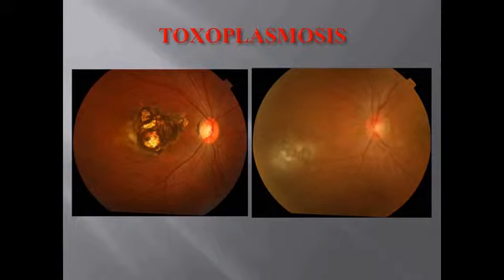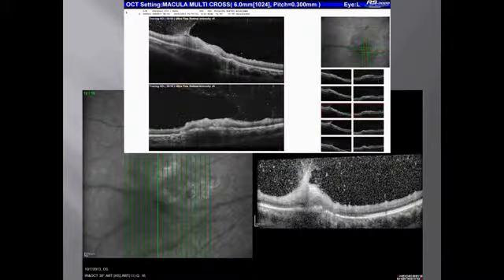I'm just showing you some of our experience because what we noticed is that with this particular Nidek OCT, the vitreous interface is seen much better than what we see with many other OCTs. We use the Spectralis also, and it gives wonderful images, and I think they're very comparable images, but the vitreous interface here is interesting.